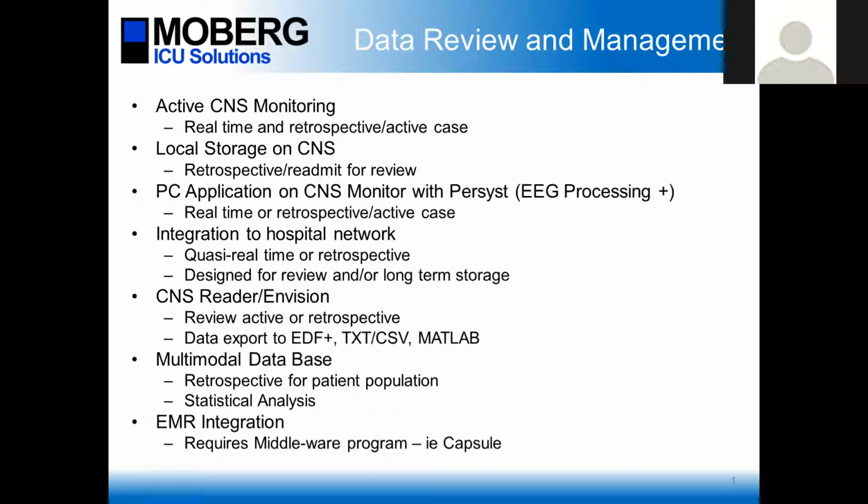So, Kathy, anything else you want to talk about in terms of networking? I know you've got a lot of experience with that as well. No, I think you did a great job covering the ins and outs. And because I've not used it on the EEG side as much, that's helpful to hear from you too.